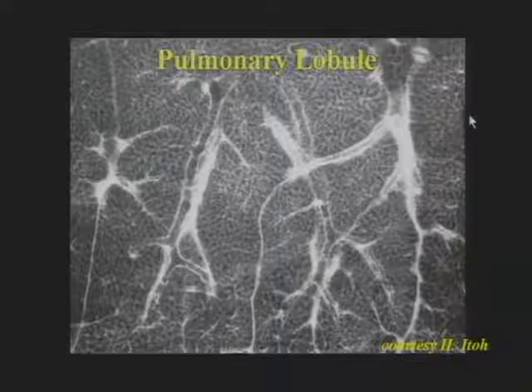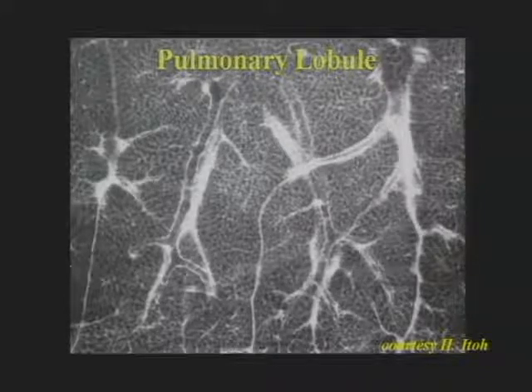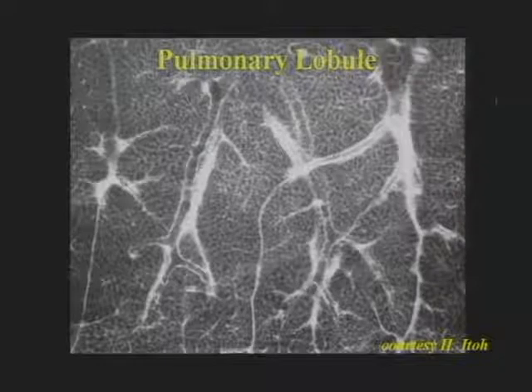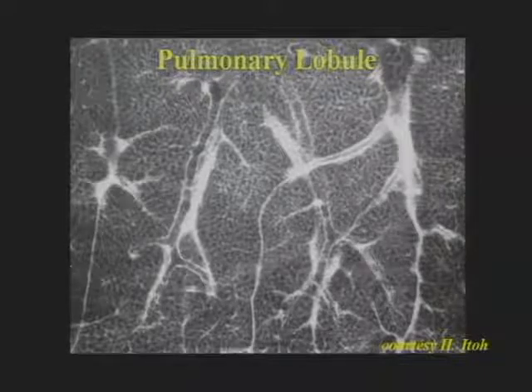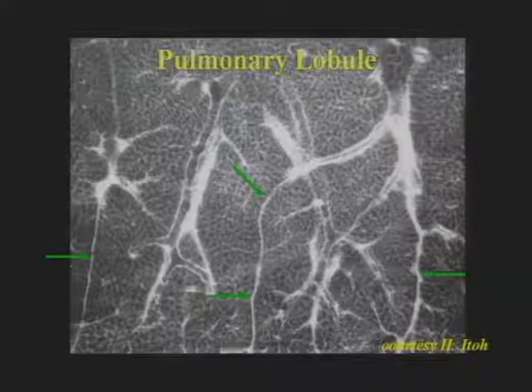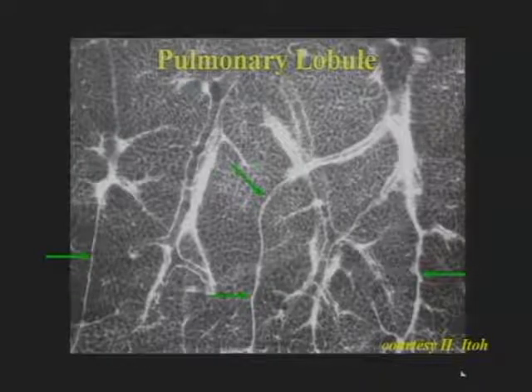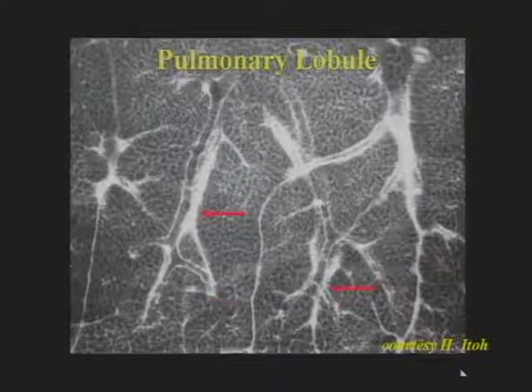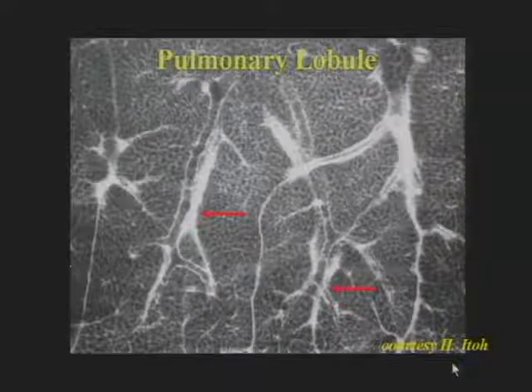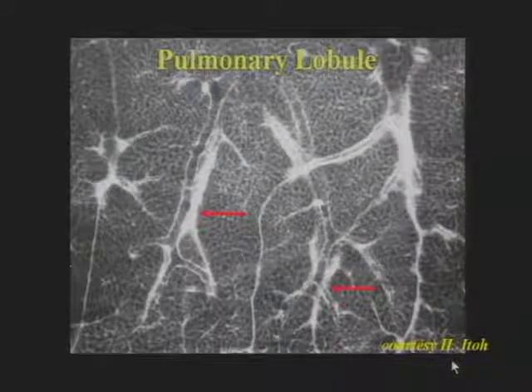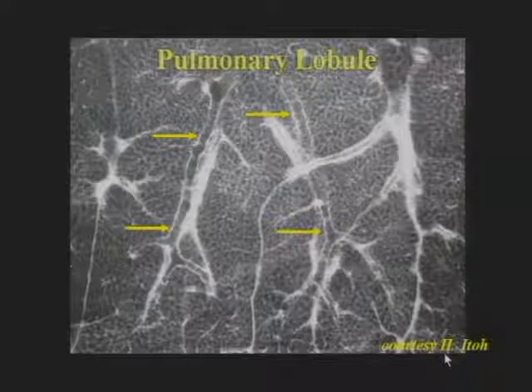I'm going to begin by briefly reviewing the anatomy of the secondary pulmonary lobule, and some of the abnormalities we identify because of abnormalities of the pulmonary lobule. This is a radiograph of a lung slice of two adjacent pulmonary lobules. The lobules are marginated by connective tissue interlobular septa, which contain pulmonary vein and lymphatic branches. In the center of the pulmonary lobule is a branching centrolobular artery, large enough to see on high-resolution CT. Adjacent to it is the centrolobular bronchiole, which is too thin-walled to be seen in normal subjects.